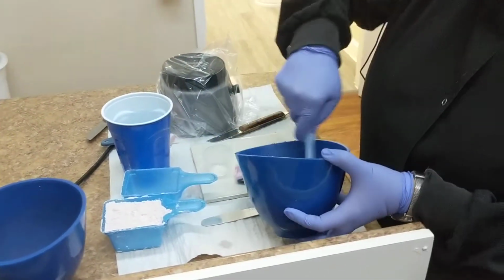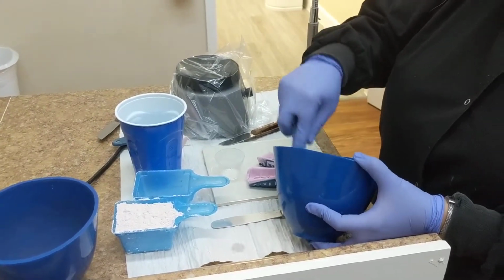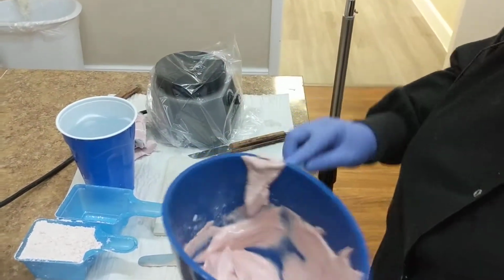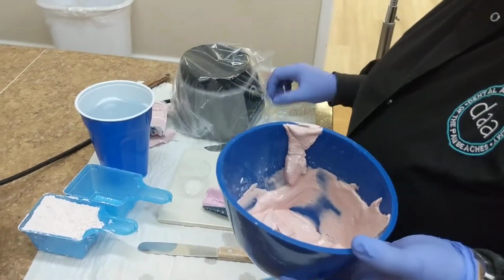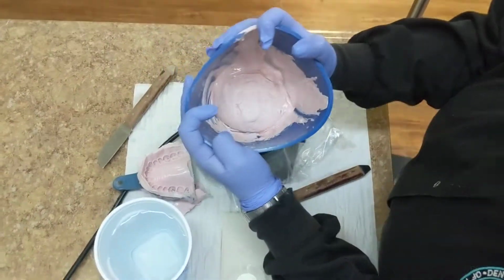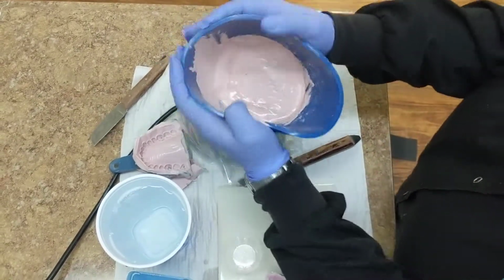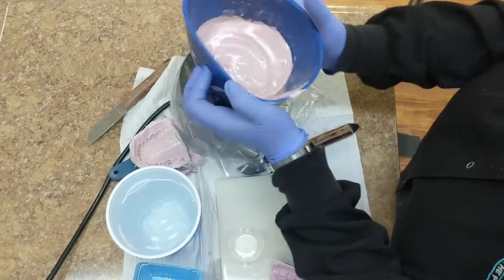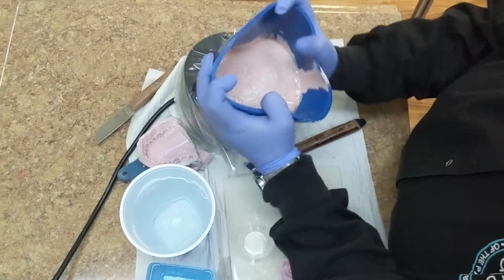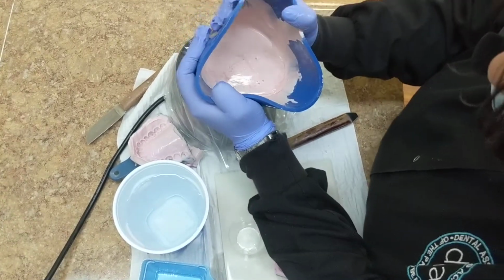But since I'm instructing right now, I'm gonna make a little extra stone so it gives me more time. And when you're learning, you could do that as well. That's better. So we use a machine called a vibrator to get the air bubbles out. So I kind of like to flex the vibrator on, like kind of push the ball into the vibrator, that's what I meant. You do this for about 10-20 seconds. Because if you stay here the whole day trying to get these air bubbles popped, the stone will set on you.